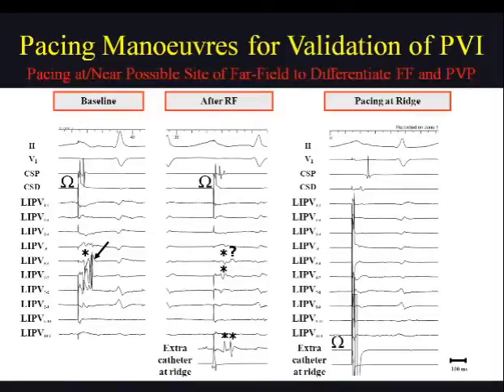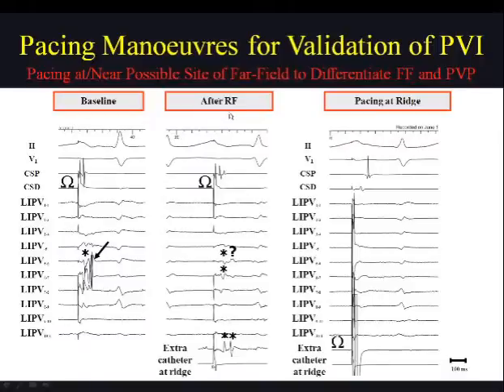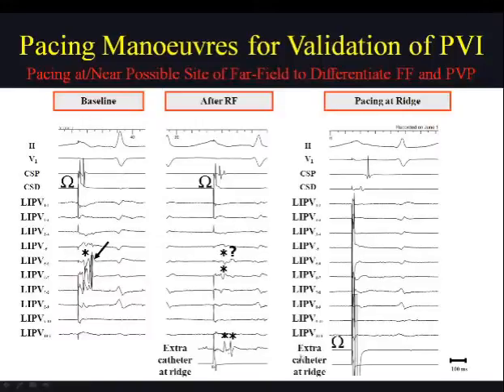Here is an example of far-field pacing validation in the left inferior pulmonary vein during CS distal pacing. At baseline, there is a fragmented far-field potential and a sharp PV potential. After proximal ablation, the electrograms are slightly split but it is unclear whether this is a PV potential or a split far-field. Placing an extra catheter at the ridge and recording the split potential there indicates it is likely a double far field. Pacing on the ridge completely anticipates the potential, confirming it as a double far field unmasked by differential pacing.